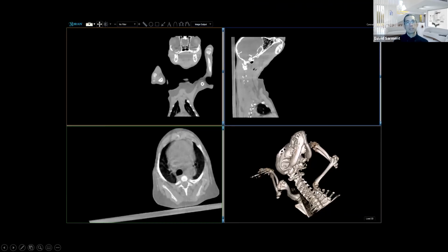This image is showing you a different sort of patient. If they're small enough, you can picture other areas of the anatomy, and we'll take a look at a couple of those extremities as well. But what I want to point out to you is that yet it is a nice looking 3D, and it is going to be very useful for spine and extremities.